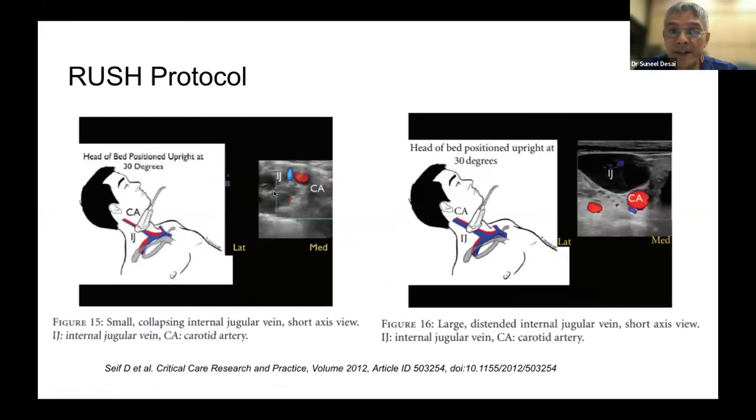And they also pointed out way back then that you could use the jugular vein if you can't see the IVC. You can't always see the IVC in every situation. Sometimes the epigastric view is not available because of surgery in that area or abdominal pathology. And the right flank view is quite handy to be able to do, but that's also not always present unless the vein is congested.